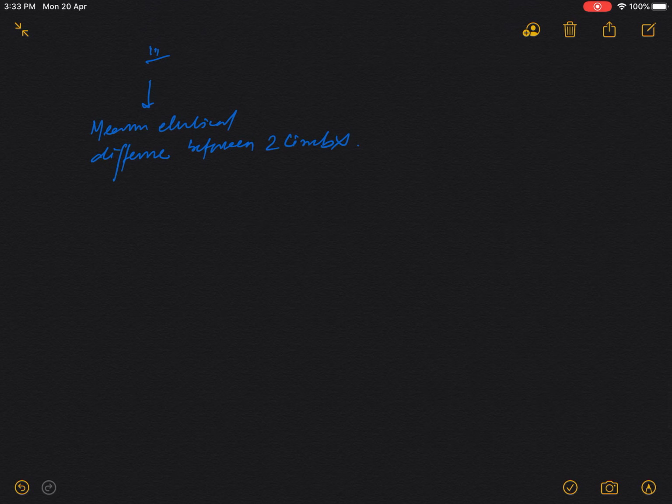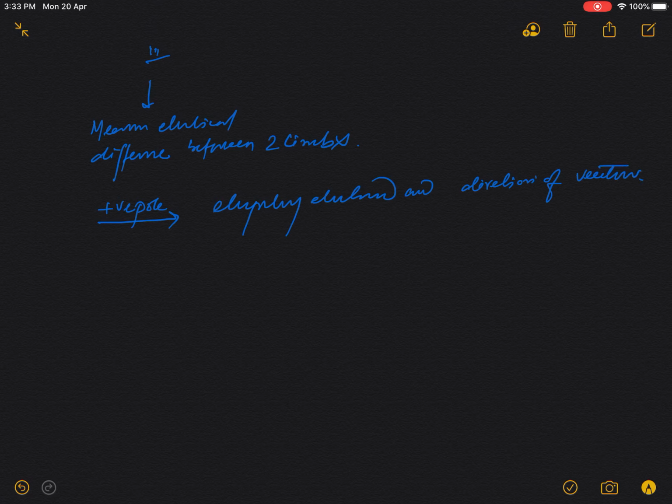The point which is connected to the positive pole is called the exploring electrode, and it detects the direction of the electrical vector. The negative pole is the reference electrode, and the tail of the electrical vector is shown by the negative pole.